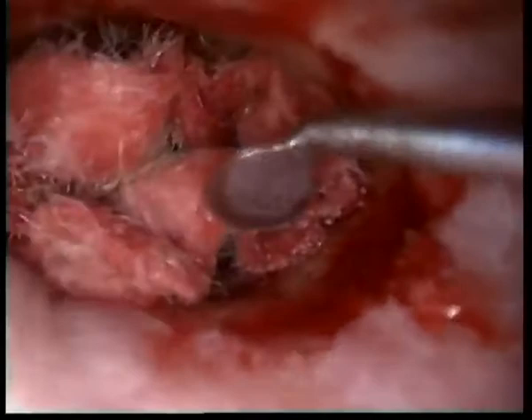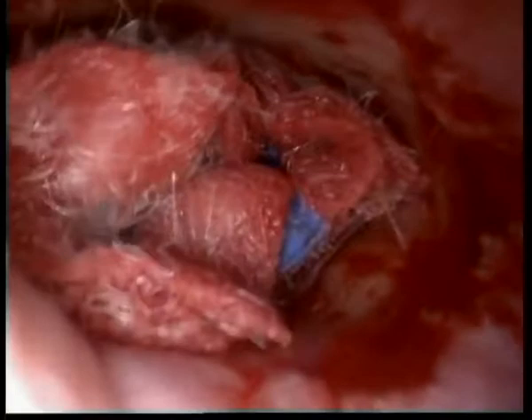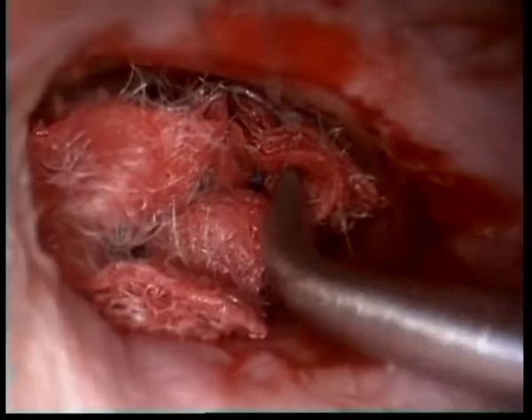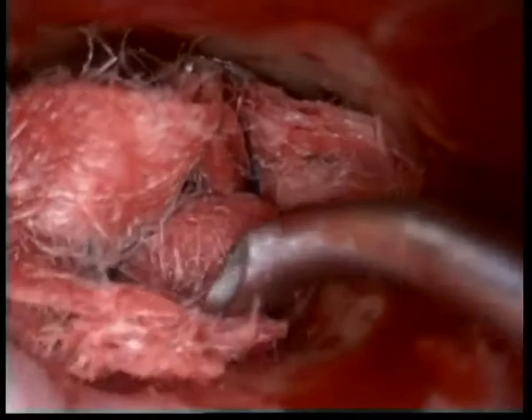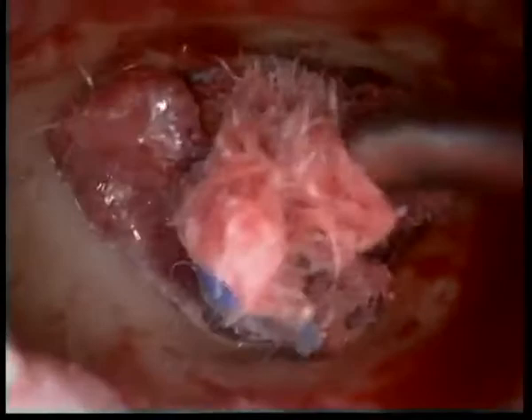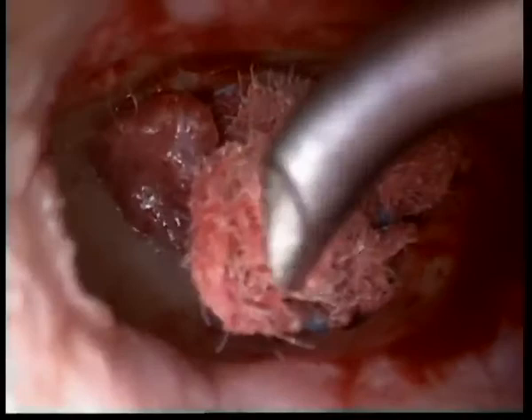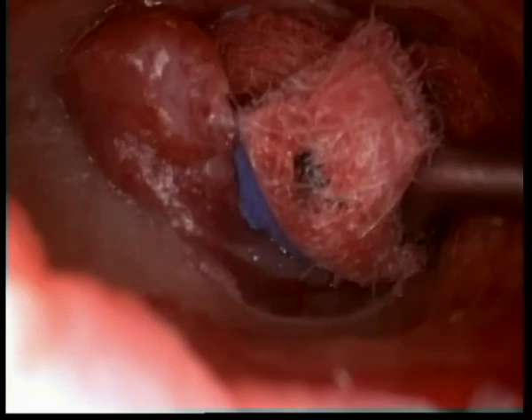A round knife, please. That's angle. No, no, but like a little one. This is a section. I'm elevating the skin further. Again, we gotta leave the annulus. I see the annulus. I cannot lift the annulus. I have to keep the annulus down. So I have to push it down and lift the skin off the annulus, as you could see here.